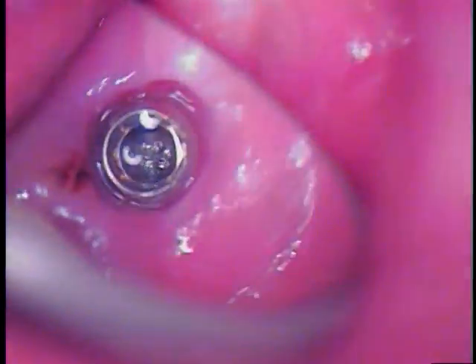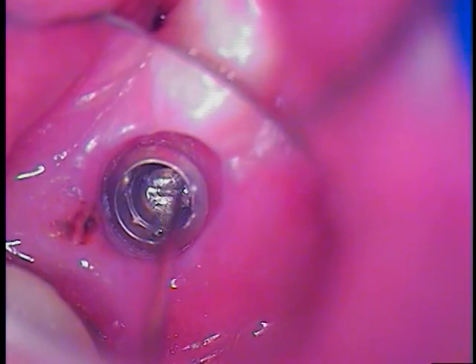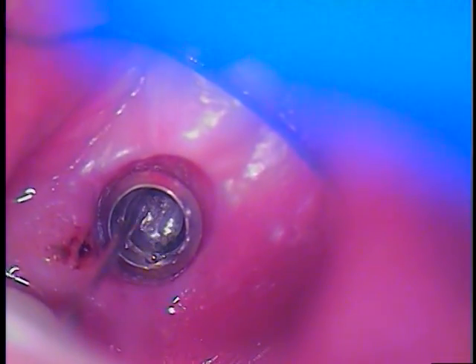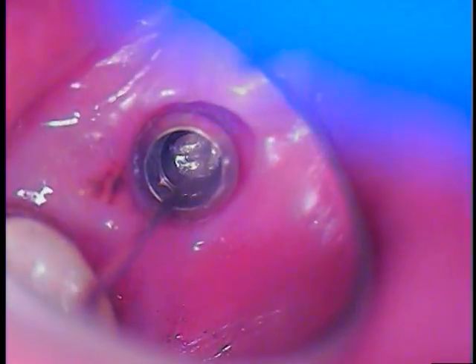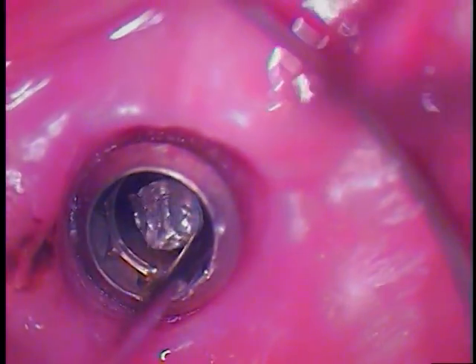We just got to tease this out. Going clockwise through the mirror — counterclockwise certainly — through suction. I would dry that off. Same instrument. So now we're just going to back it out — everything opposite. Out it comes slowly. There's always a chance of getting a piece of metal in there, so we just gently twist it out. I'll use the power of the small suction now — that would be the micro suction tip.